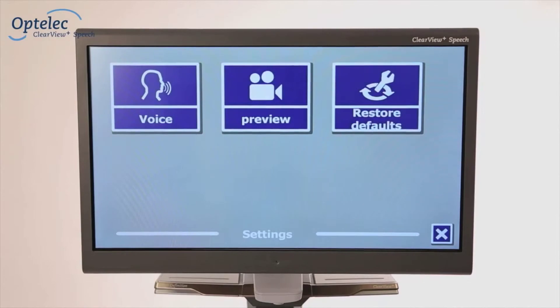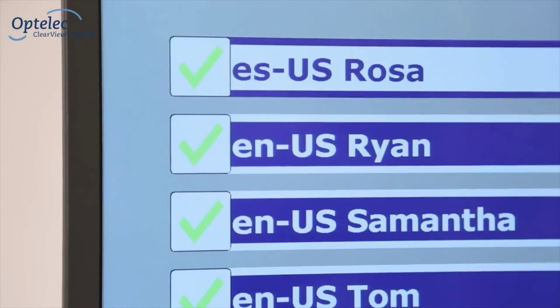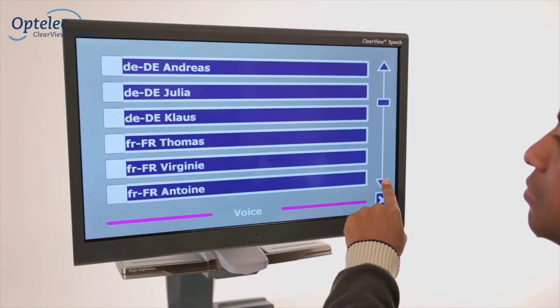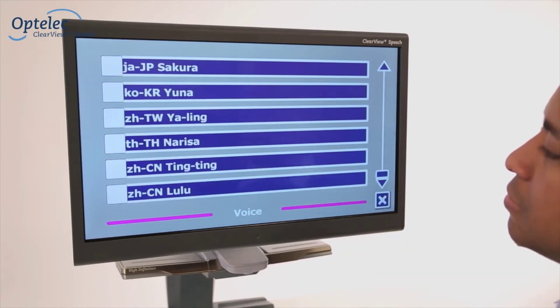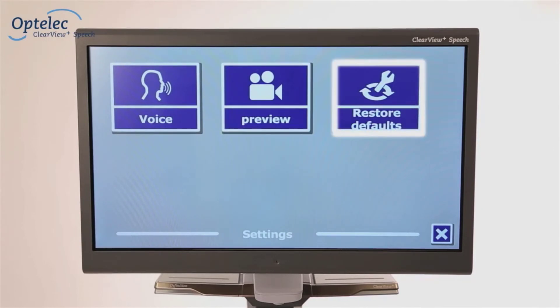The settings menu allows you to activate or deactivate additional reading voices. In total, you have over 50 voices to choose from across 30 different languages. You can also turn off the preview function or restore factory settings.